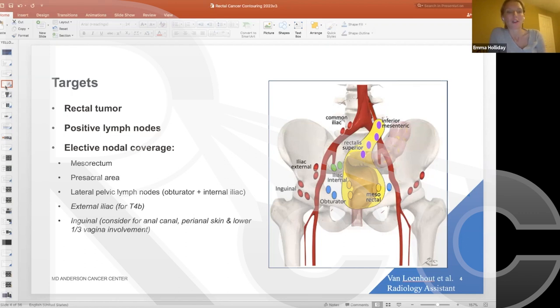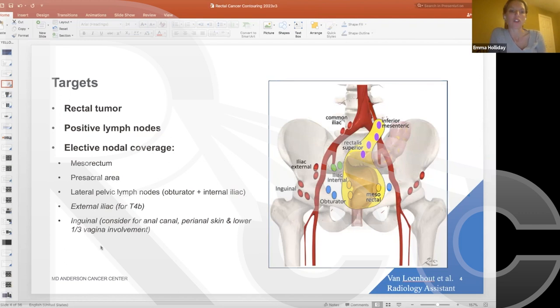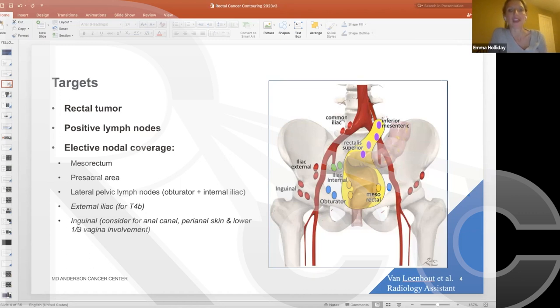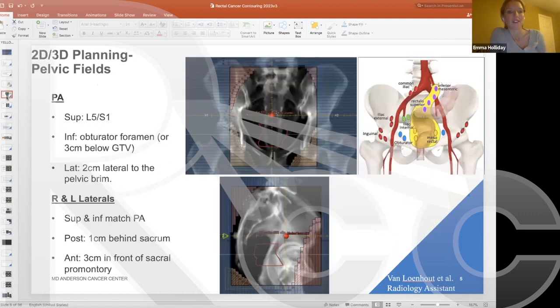The primary echelon nodal drainage areas for rectal cancer include the mesorectum and presacral area. We cover the lateral pelvic lymph nodes for all patients, including nodal basins around the obturator and internal iliac vessels. For T4b disease invading anterior organs, we extend coverage to the external iliac nodal basin. For very low-lying rectal tumors invading the anal canal, we also consider adding inguinal nodal coverage.